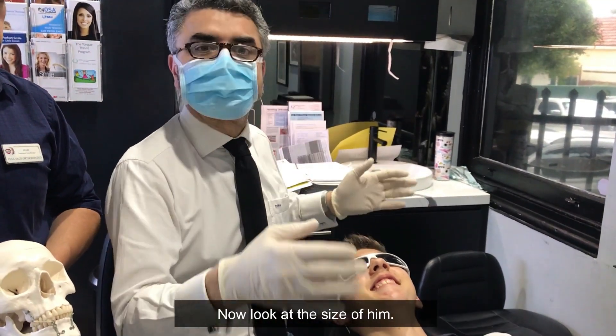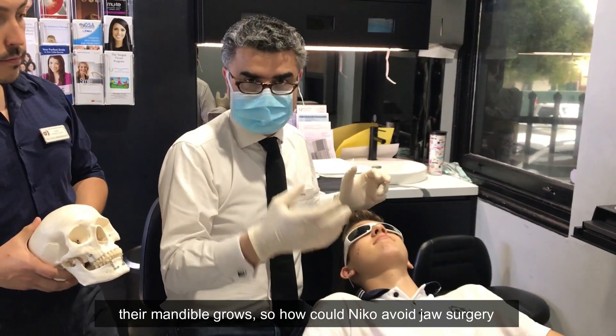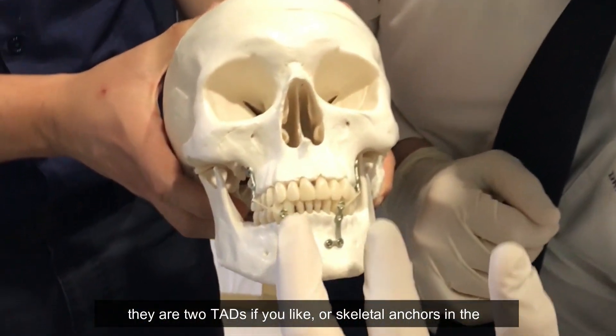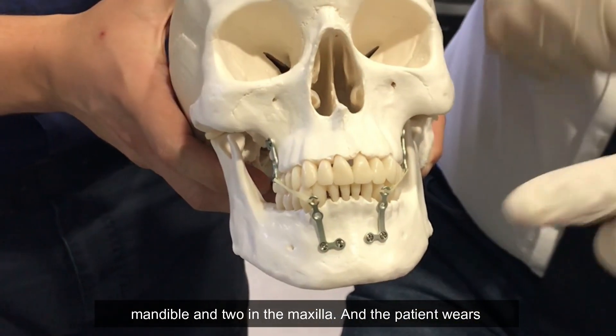Unfortunately for kids with a Class III, as they grow tall their mandible grows too. So how do we avoid jaw surgery later? We use these things called bollards. What bollards are — they're two tabs, or skeletal anchors, in the mandible and two in the maxilla.